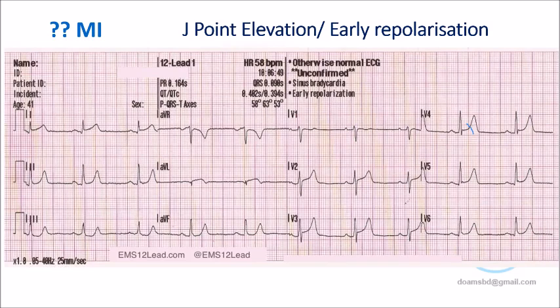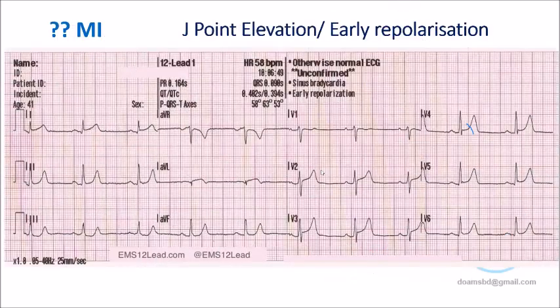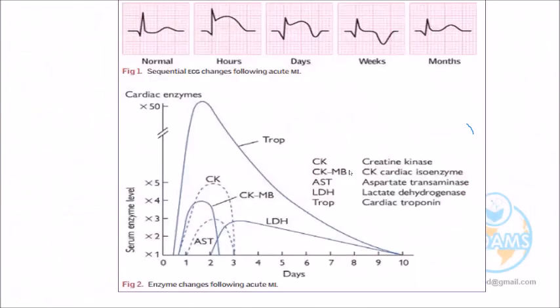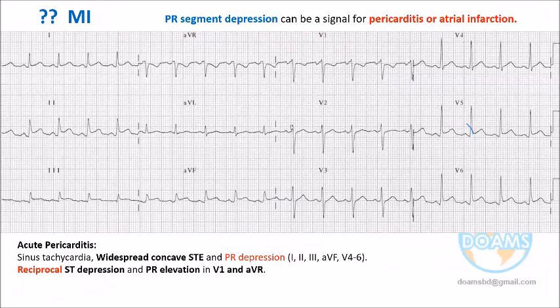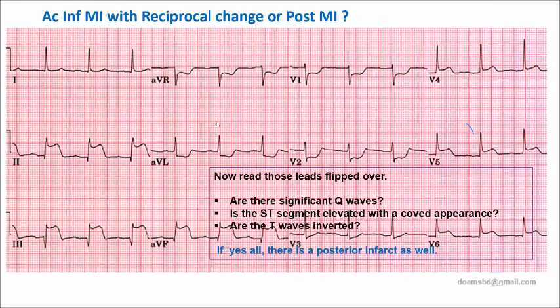Okay, so I didn't show you. I'm going a little back, sorry, to another ECG, where we said this is MI. Sorry, I need to go back for better understanding. Here, there is also ST elevation, the typical MI. Suppose it is elevated. Yes, it is elevated. So you cannot say from which point the T wave started. Though the T wave is visible, you cannot identify the starting point.